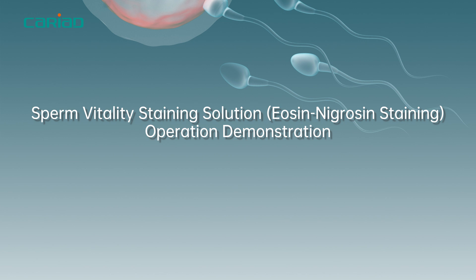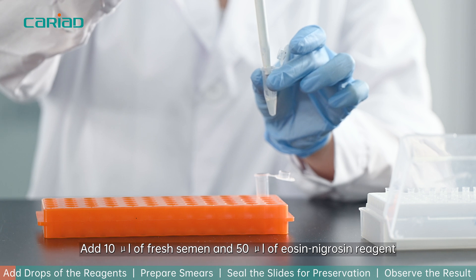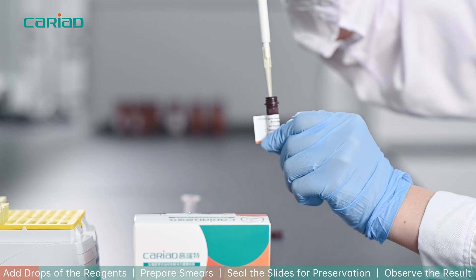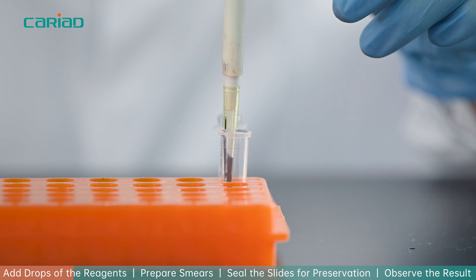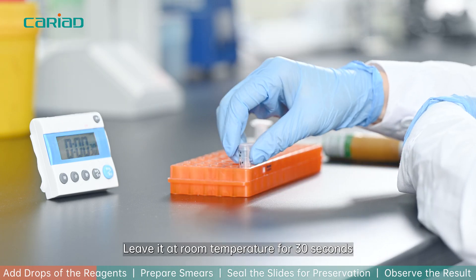Sperm Vitality Staining Solution — Eosin-Nigrosin Staining Operation Demonstration. Add 10 µL of fresh semen and 50 µL of Eosin-Nigrosin Reagent to a test tube. Mix them gently. Leave it at room temperature for 30 seconds.